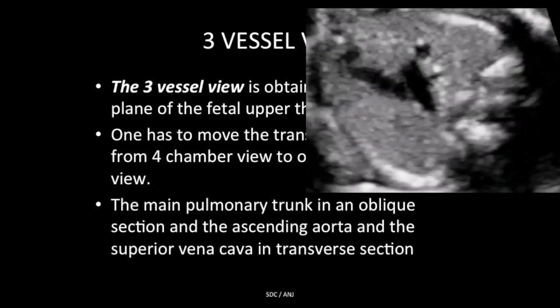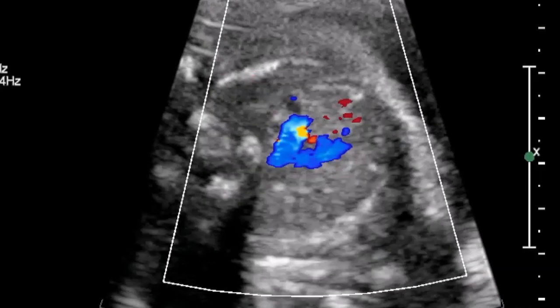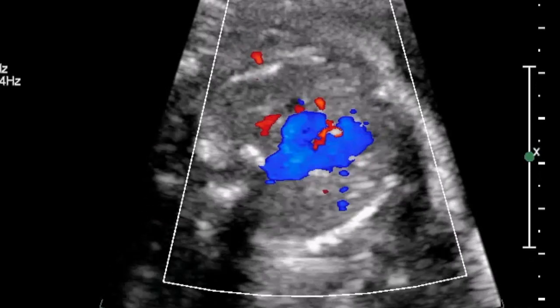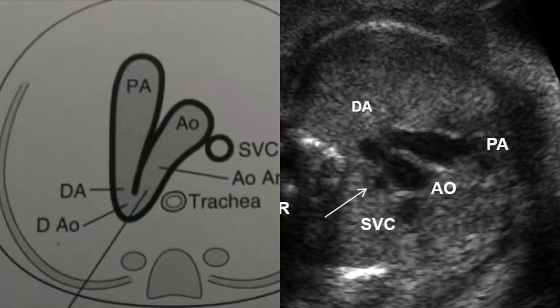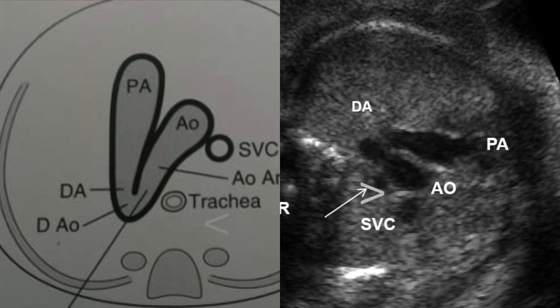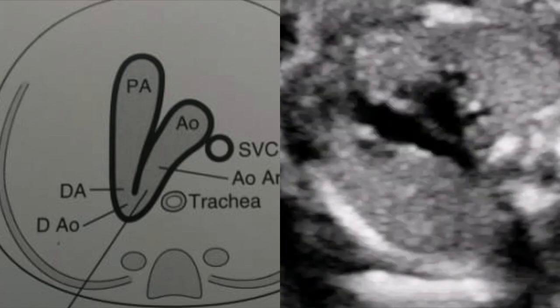In the three vessel trachea view, you will see the aortic arch and ductal arch merging together with an acute angle between them. Both arches are located to the left of the spine and trachea, which is an important anatomic landmark. They usually form a V-shape structure to the left of the spine and to the left of the trachea. The arrow here points to the trachea, with the SVC, aorta, pulmonary artery, aortic arch, and ductal arch all visible.